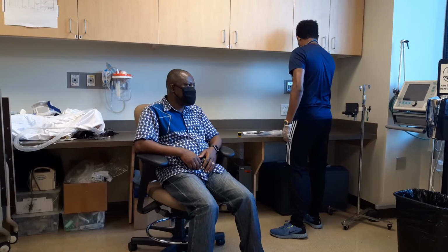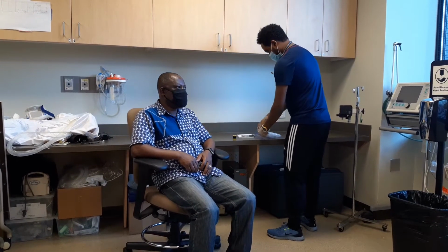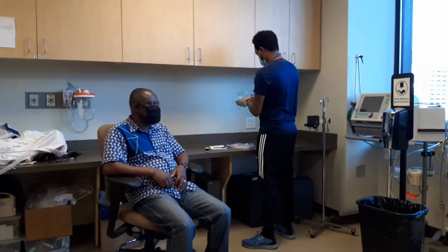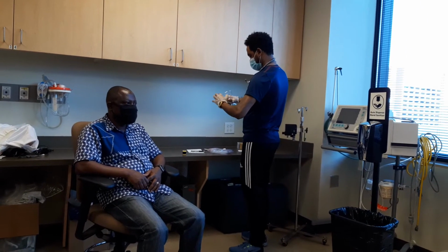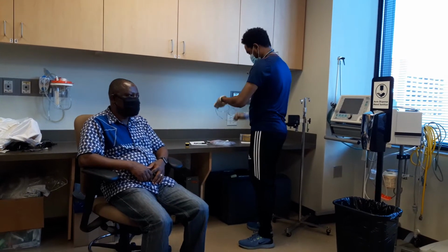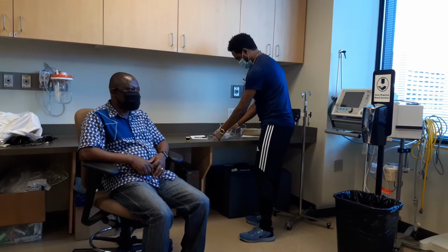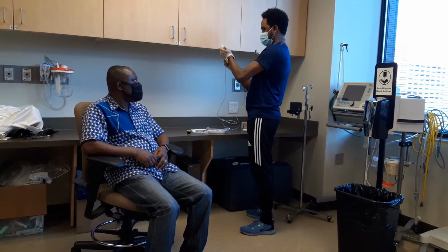I'm going to plug in my flow meter and hook the pipe. Squeeze it right in here.